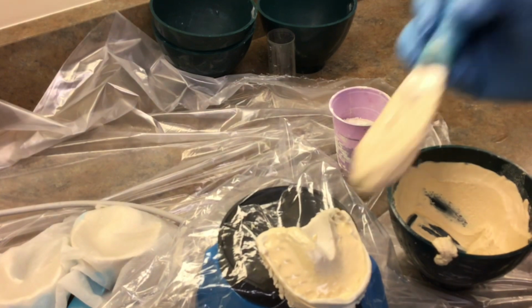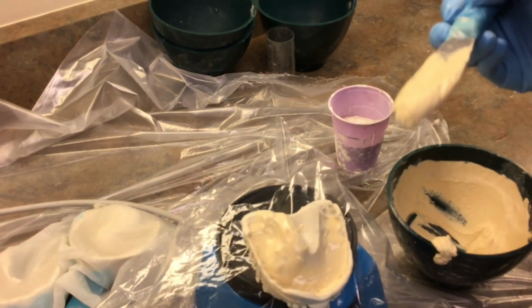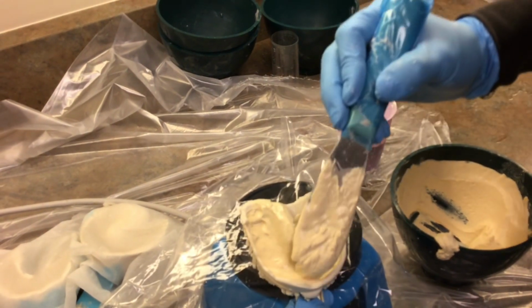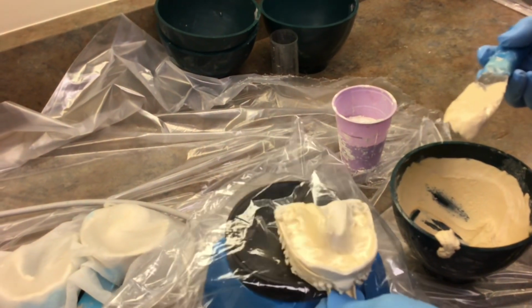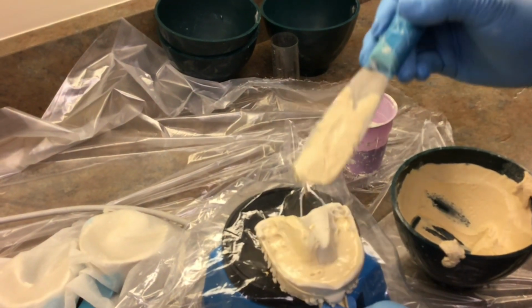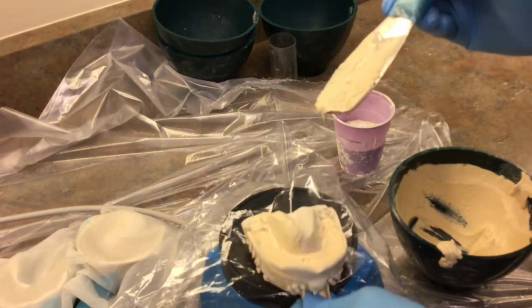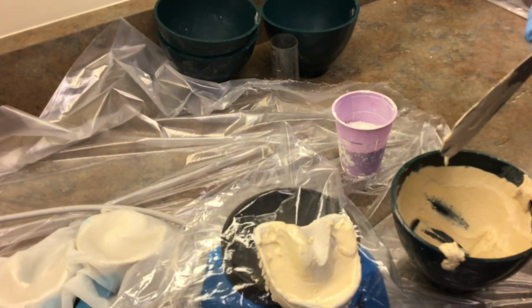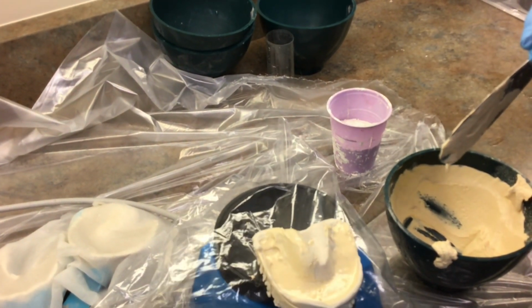And then to make sure that there's no air bubbles, because a lot of times air bubbles will come up. See, there's some air bubbles right there coming up. You can take those out, or you can push them down to make sure that there's no air bubbles. There's an air bubble there. So you're gonna make sure there's no air bubble. You can pop them, make sure nothing comes out. Now all my teeth, you can notice, are covered. They're completely covered, no air bubbles.